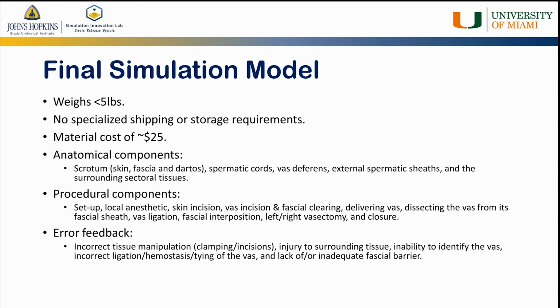Procedurally, it allows users to perform all 10 key tasks, including the setup, local anesthetic, skin incision, vas incision and fascial clearing, delivery of the vas, dissection of the vas from its fascial sheath, vas ligation, fascial interposition, left and right vasectomy, and closure.